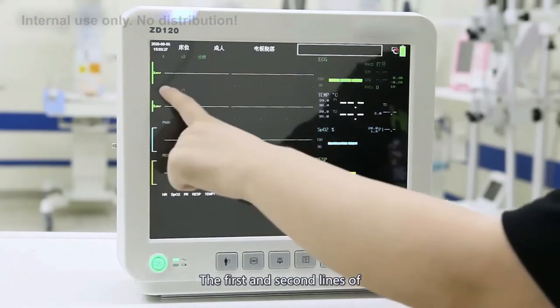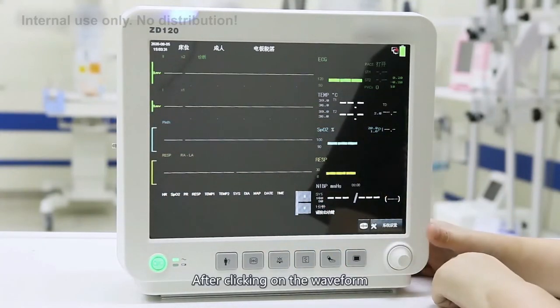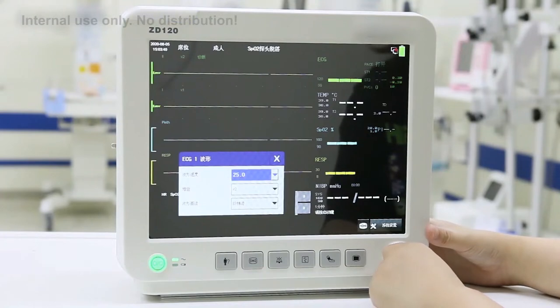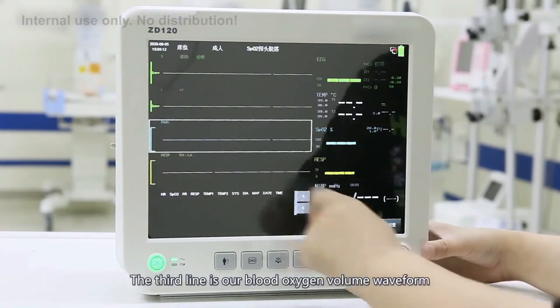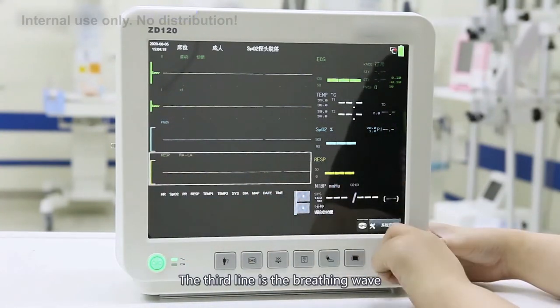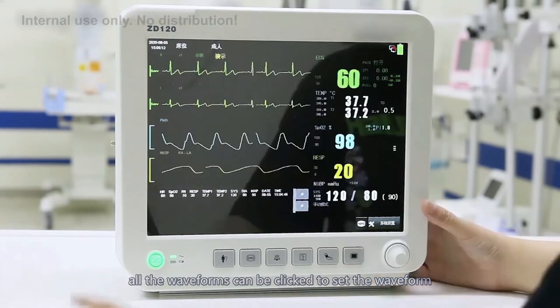The first and second lines of the waveform area are the ECG waveform display area. After clicking on the waveform, you will enter the ECG waveform setting interface, where you can set the ECG waveform speed and gain — it is recommended to select gain automatically. The third line is the blood oxygen volume waveform, and the fourth line is the breathing waveform. All waveforms can be clicked to access their individual settings.